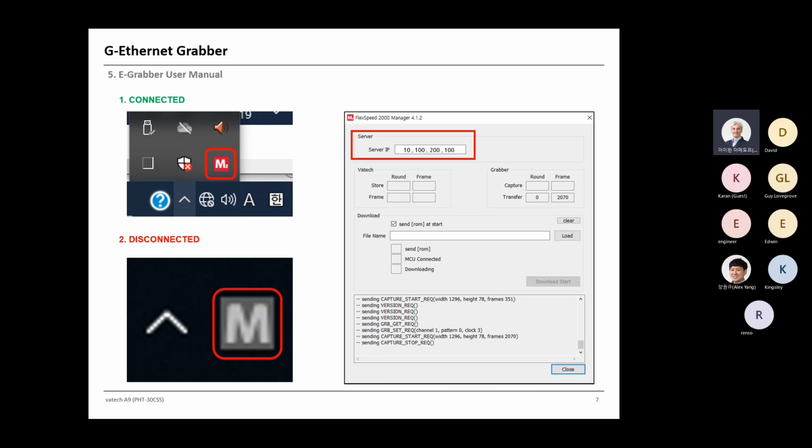Usually, whenever you switch the PC on, it will automatically get online. There should not be any problems with this one. But just in case you have any connection issues or any image acquisition problems, you might want to check this one too, because without this, image acquisition is not possible. So it should always be on.